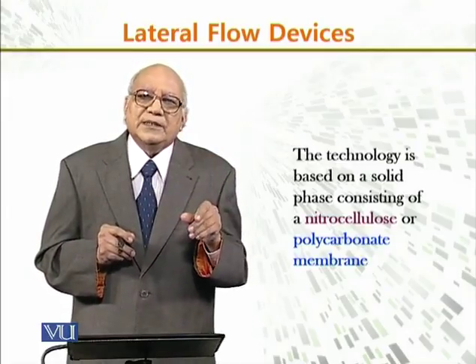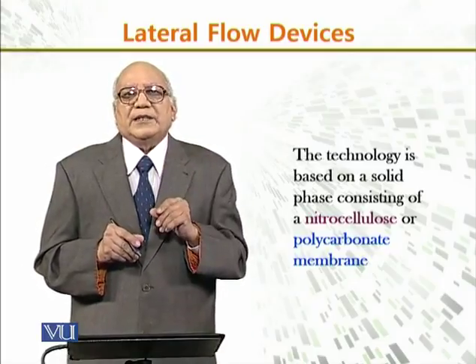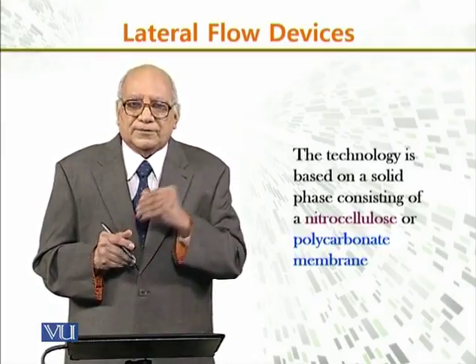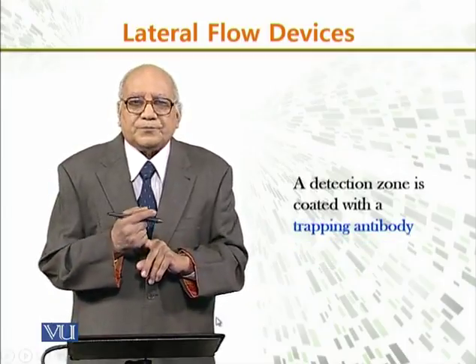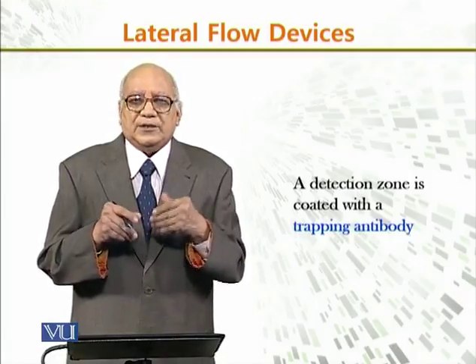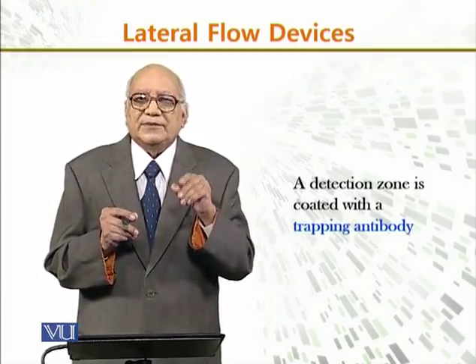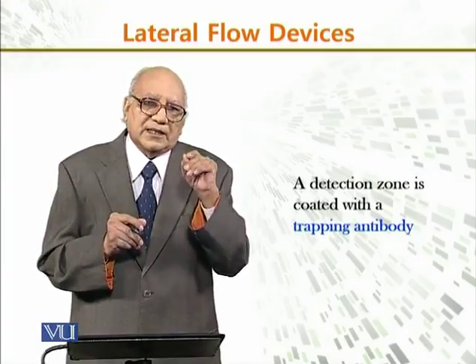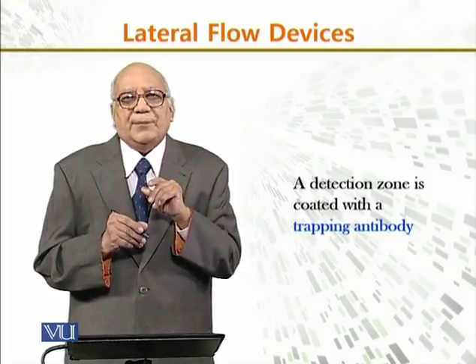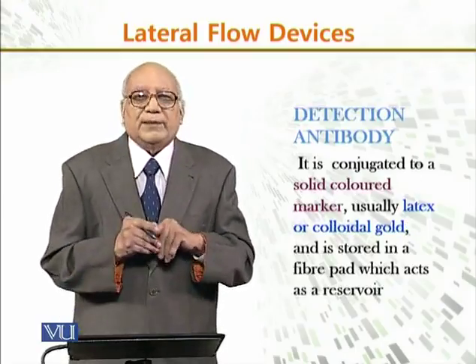So the strip is, as a matter of fact, a nitrocellulose or polycarbonate membrane, and it provides the solid phase of the material. There is a detection zone that is coated with a trapping antibody. As we have seen in the earlier diagram, the detection zone is coated with the trapping antibody on the solid phase of the nitrocellulose membrane.